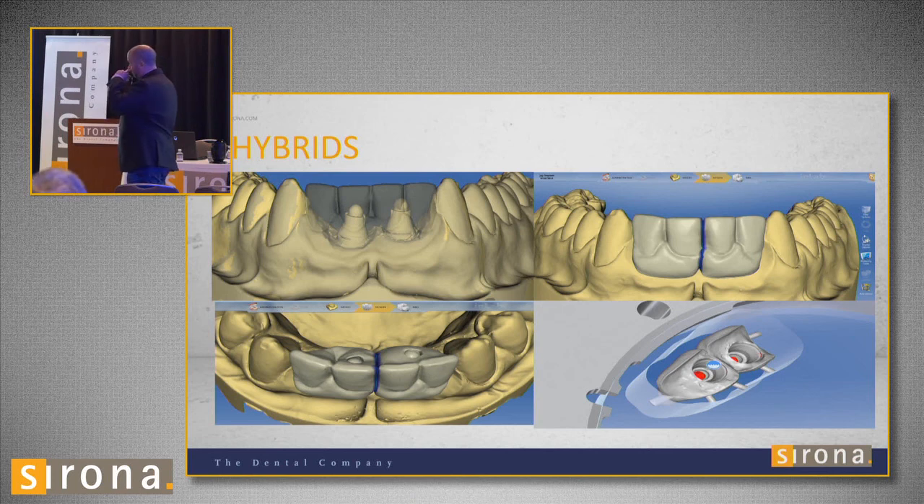For hybrids, right now you have to do it the hard way — wax it up first. I bought two multi-unit abutments, waxed up the case, called it a two-unit bridge, and biocopied the wax-up. Then I milled it out. I made my own screw holes manually — I used a reduce tool, made the crowns transparent, drew where I thought the hole would be looking down into the abutment, then used the subtract tool to go all the way down and make a hole in the crown. The mill mills it out just like that.